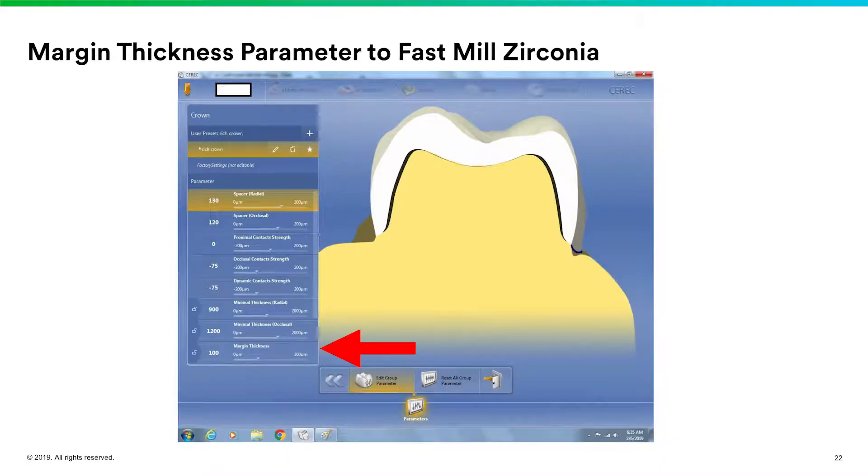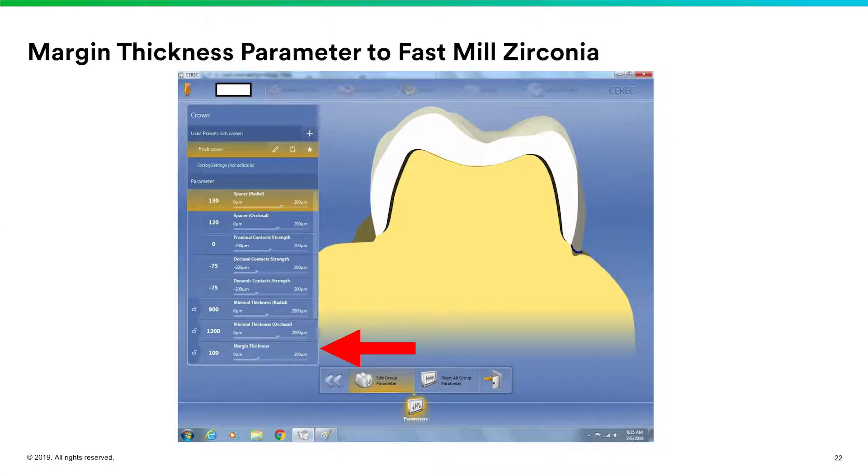A little tip: if you're going to do zirconia and trying to do restorations in a timely fashion, regular milling takes about 16-18 minutes. If you fast mill, the machine says 16 minutes but it'll actually take about 10 minutes. However, you can't automatically just fast mill these restorations — you need the proper setting in your CEREC parameters to allow fast milling. Take a look in the parameters screen for your zirconia settings, and you'll notice at the bottom where it says margin thickness — you need to make your margin thickness 100 microns.